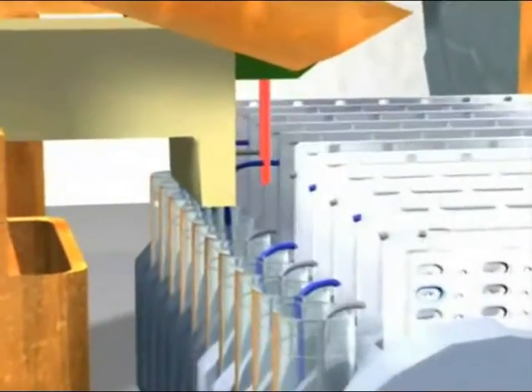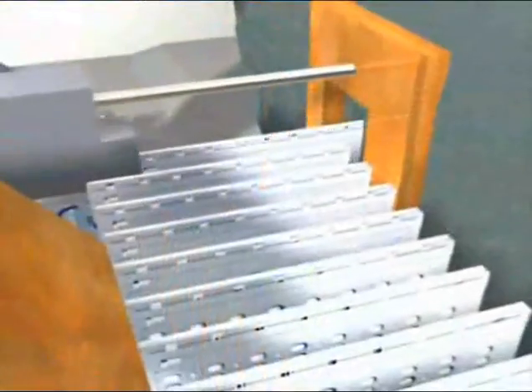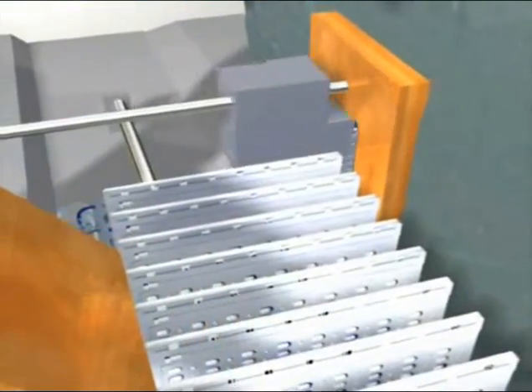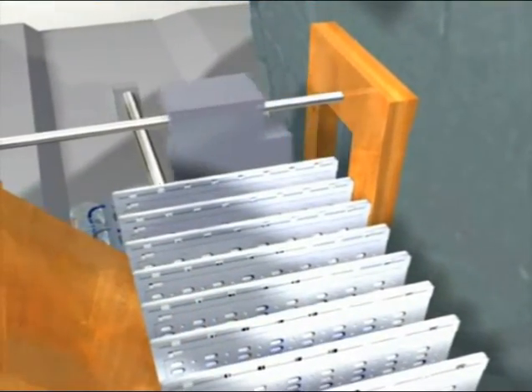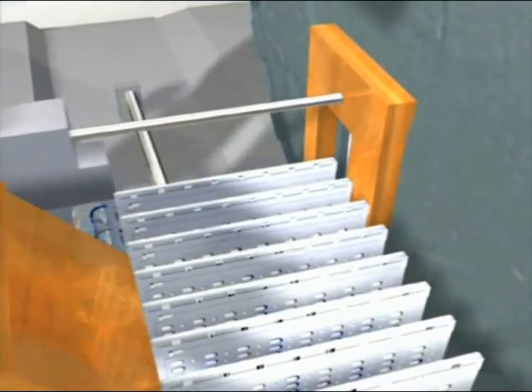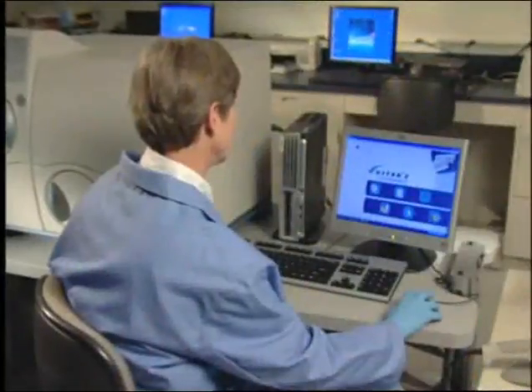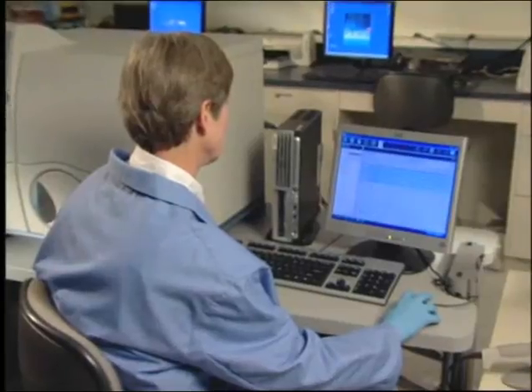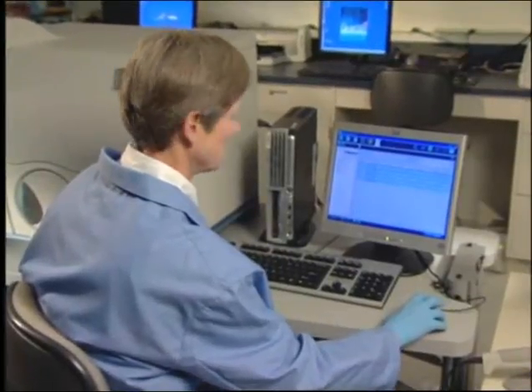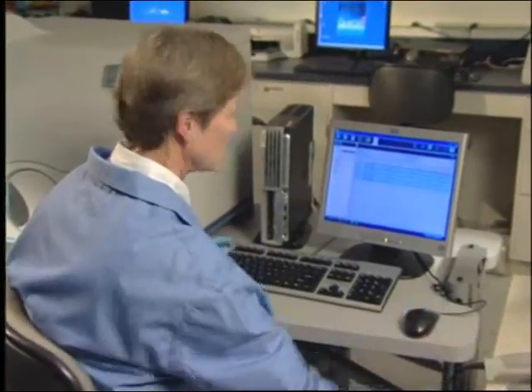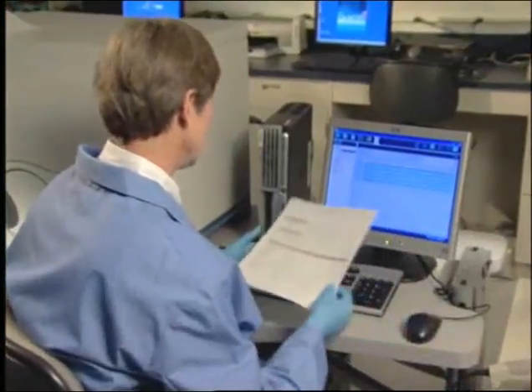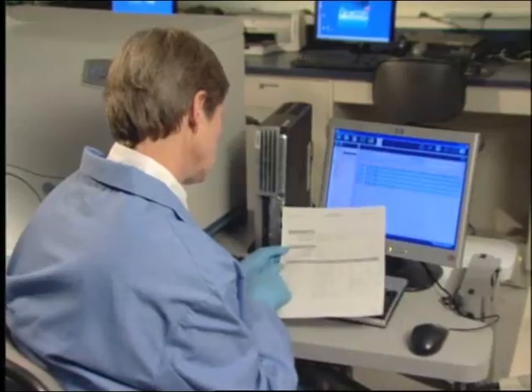When all information is accepted, the transfer tubes are cut and the cards are sealed and loaded into the carousel. The instrument alerts you to remove the empty cassette. While the cards are processing, you will enter the card and cassette information into the Vitek II Compact workstation.